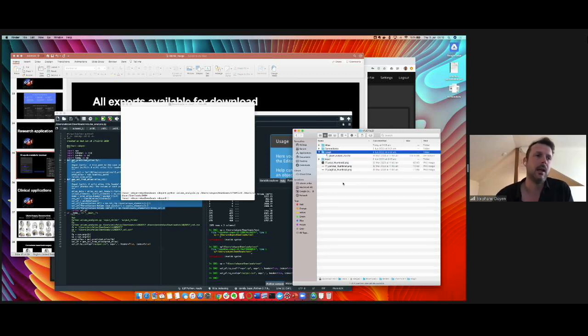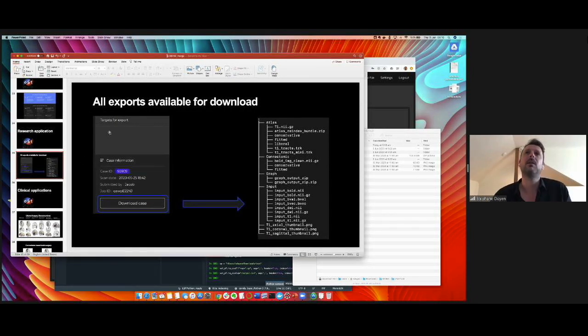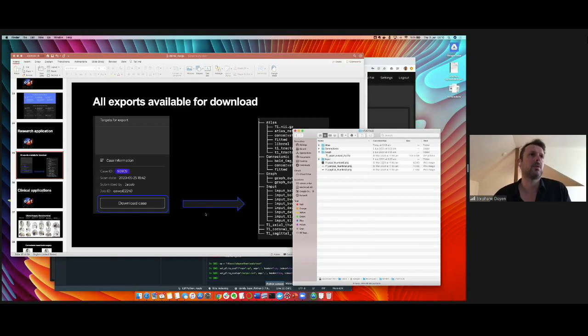Let's say you want to see how the adjacency matrix could change from one test to another. The same thing applies. You test one subject, you acquire the data, you push it through the platform, download it back, run your analysis, and off you go. So really a lot of powerful tools available for researchers, and a wealth of data for your research paper.